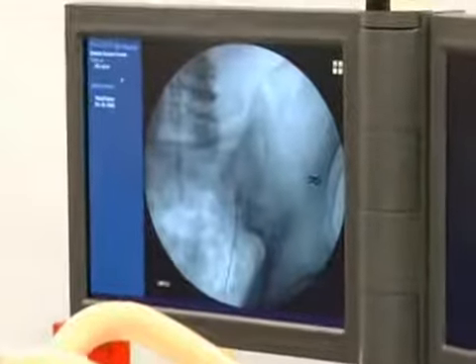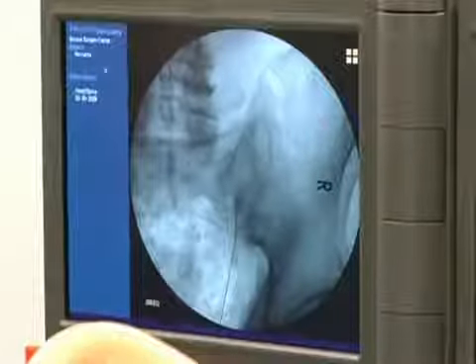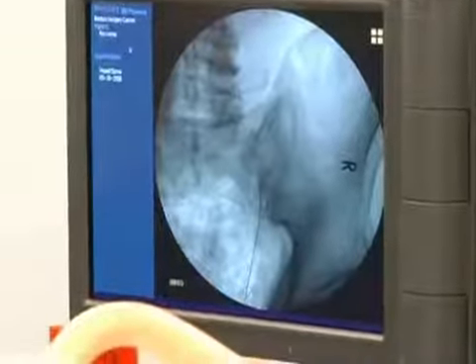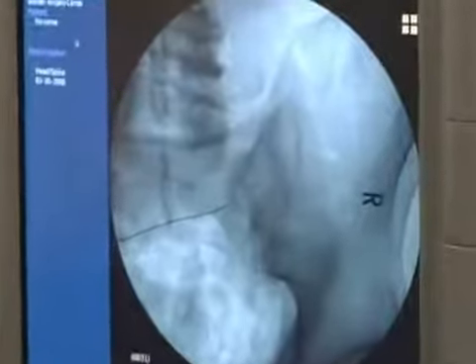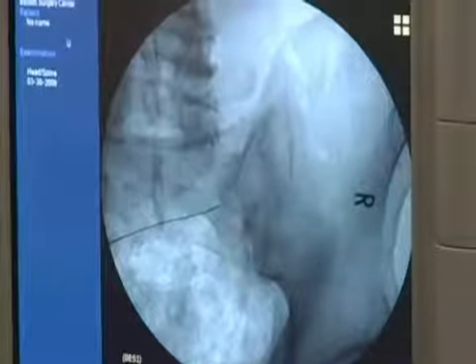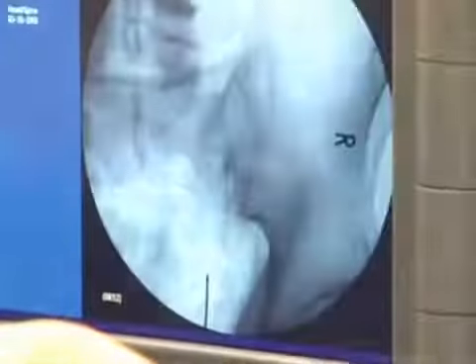Okay, so now that's likely as far as I'm going to go up the joint with a 25. It just doesn't have any stiffness to really drive it. Put your local anesthetic syringe in, infiltrate as you back up. Then I'll come medial. If you have to go to plan B to get into an SI joint, when you're in ligament, it won't inject, so you have to pull back and hopefully it gets numb. About 30% of the time I'm actually able to do that, and the patients are pretty comfortable. Other times, they need narcotics afterwards to make them more comfortable in the recovery. Compared to where you tested bone, same place. Same place. Yep. It's now going through that skin mark.